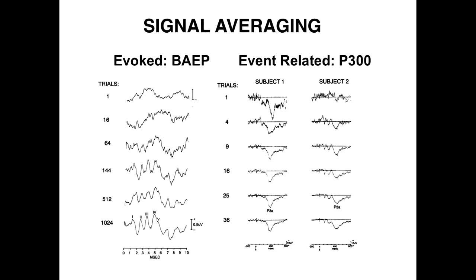Now you said, wait, 1,000 trials must take forever, but because it's such a short latency response, this is 5 milliseconds, right? 5 milliseconds, we give the stimulation rate at 11 per second. So it's done in 2 minutes. You get your 1,000 trials. So it's pretty simple.